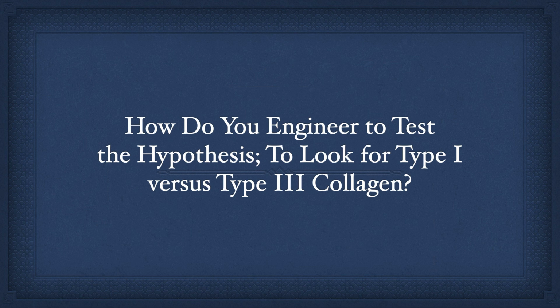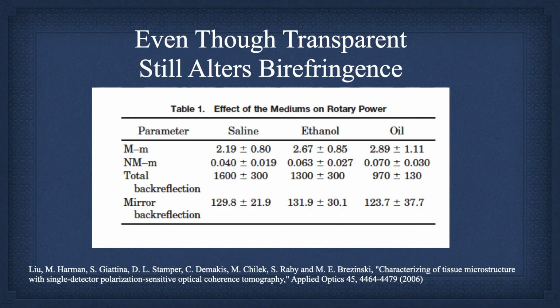So can we engineer our way specifically to our hypothesis, which is looking for plaques that have more collagen type 3, and start looking if this is associated with healing? Well, this goes back again to that paper and numerous other papers we had published in the first decade of the millennium.